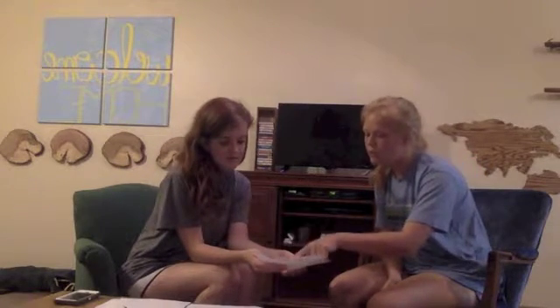So, I have a question with this. With the volume control, you said you're going to program them earlier. Do I need to be messing with the volume control on my own, or is it programmed through the hearing aid? So the hearing aid is programmed to fit your individual needs, but you also have the ability to control the volume as well. Good question.